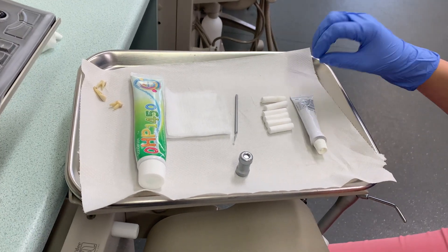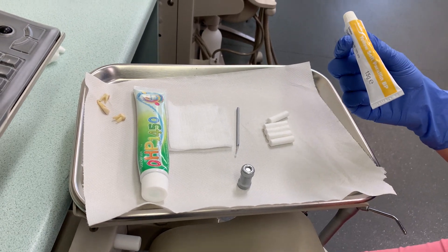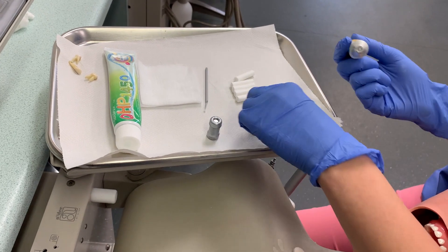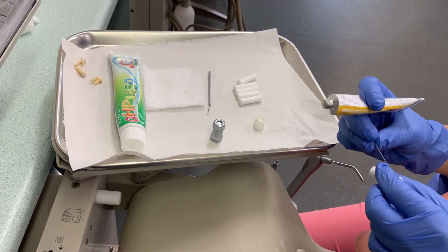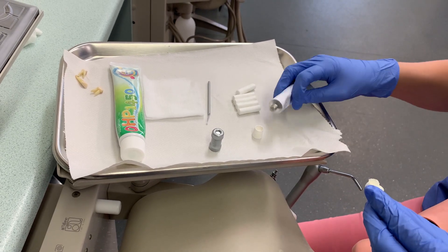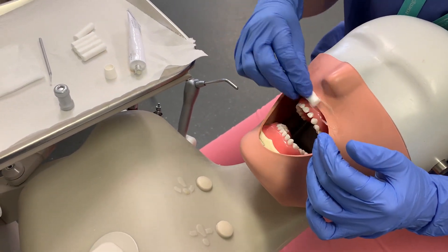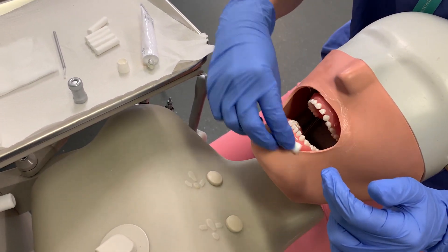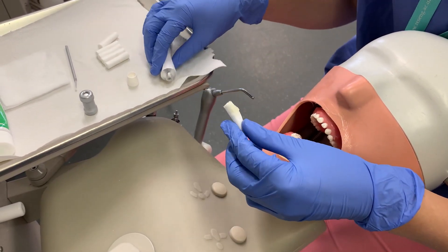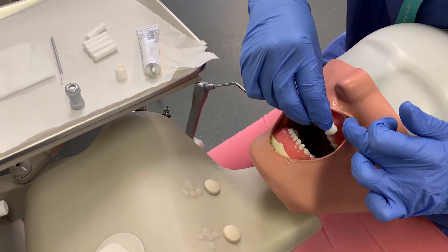First things first, after you've got informed consent, what you want to use with SDF is some Vaseline. That's because it stains the soft tissues, and although it's a temporary stain it can last from one to three weeks. It looks almost like an ink stain on the skin, so you'd want to get it on the lips and even on the skin around them, depending on how wriggly the kid is. It also stains the gingiva if it comes into contact with them.